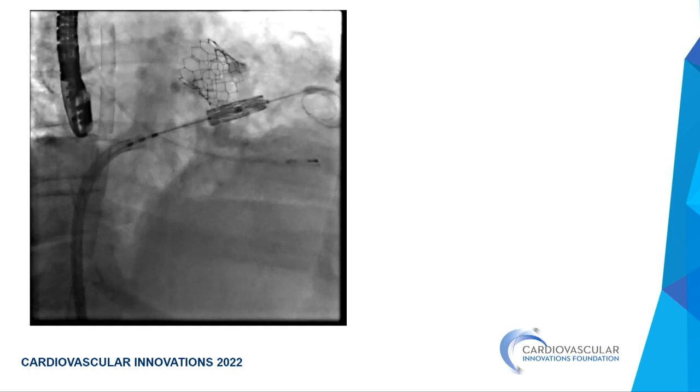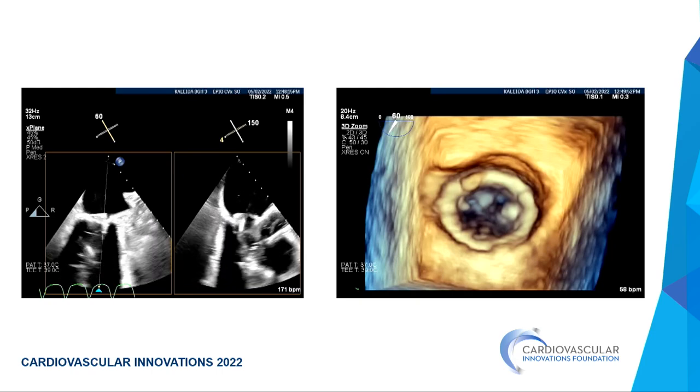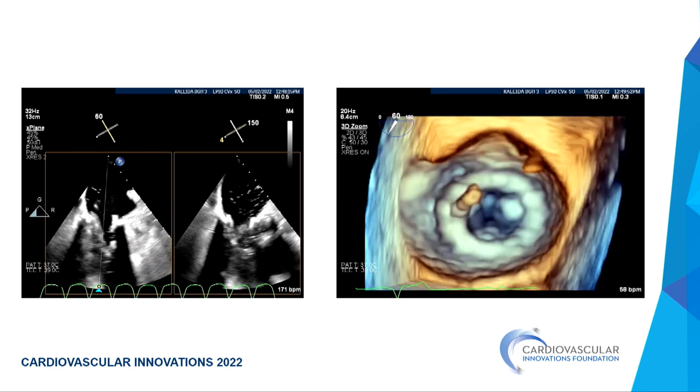Until after you've deployed it, you're still worried about valve embolization, you're worried about outflow tract obstruction, you don't know if the patient's going to crump on you. So a little bit scary. You can see balloon deployment. Can we play the right side? So fortunately, deployment looks great, very stable. I added an extra cc of volume in deployment just to be sure.